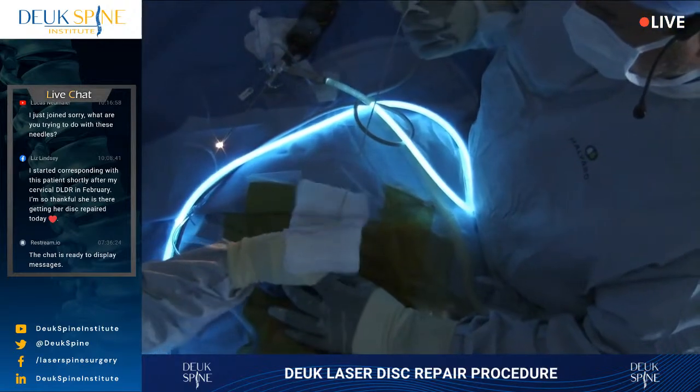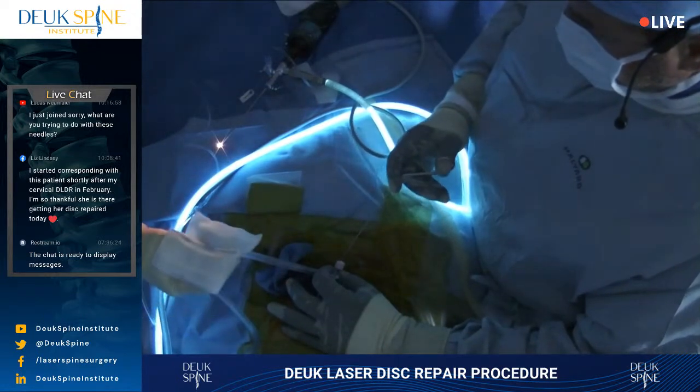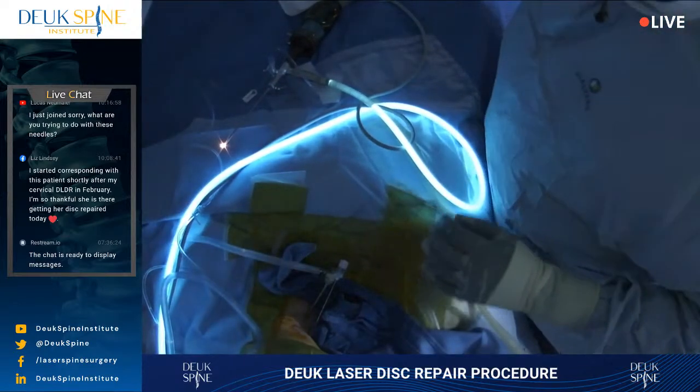I don't think I got it, but try. Yeah, you can see that for sure. There's a piece there. Now these herniations come out in little pieces.